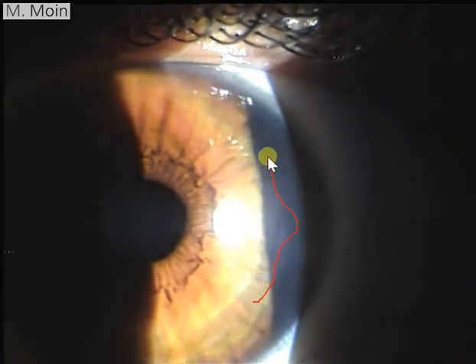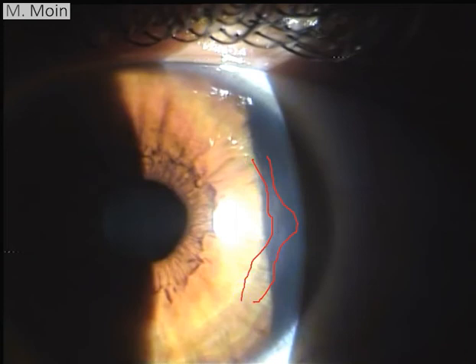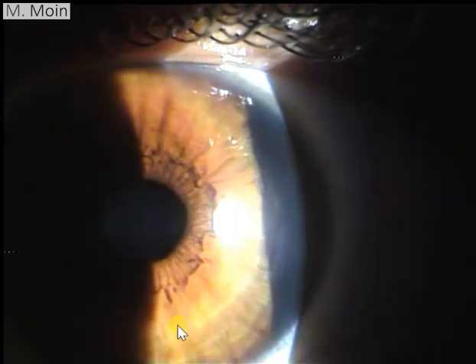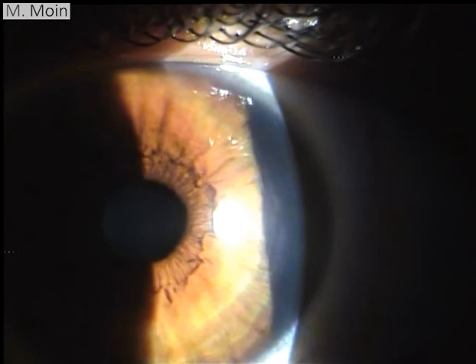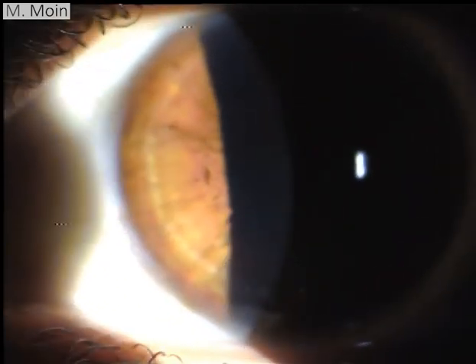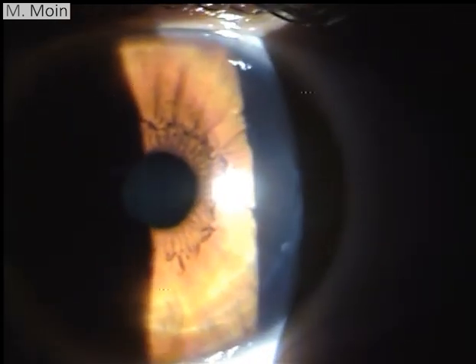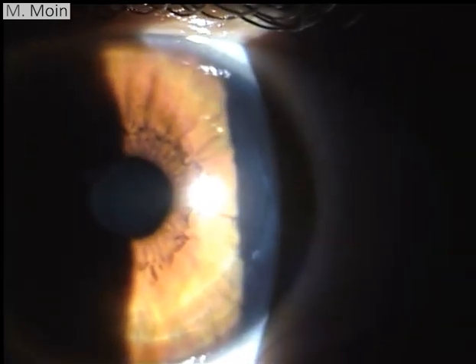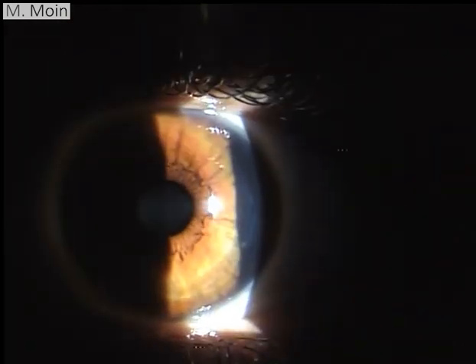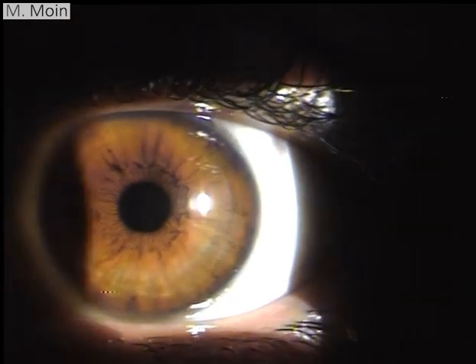Here you can see the line is more ragged or irregular compared to the other side. Once we go through this you will see again that the flap was not a very clean sharp cut in this patient. Otherwise the pupil is round, regular, and reacting.